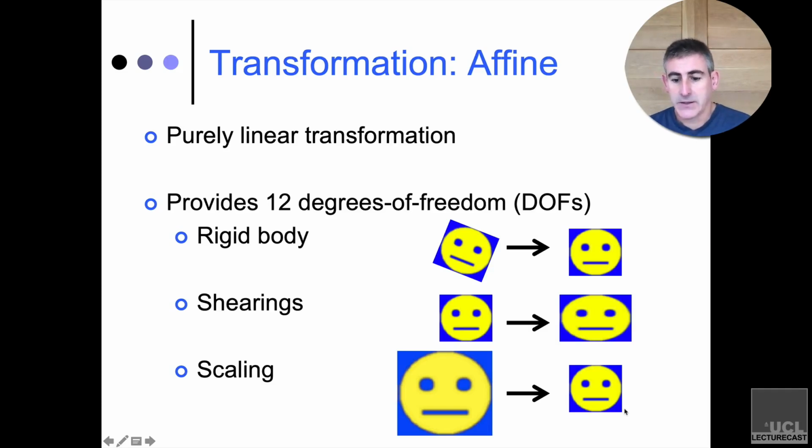The nice thing about a linear or an affine transformation is that there's only one solution. If you have 2 images and you apply a linear transformation, as long as you start with the same 2 images, you will always find exactly the same transformation. Doesn't matter what software you use, there is one solution and it's a solvable problem. And that makes it a very, very efficient thing to do because it's easy to calculate, and moreover, it doesn't vary from person to person, software to software, package to package, which is important because it means that everybody's solution is the same, right? Which makes them very comparable to one another. You can compare like with like when you're comparing linear transformations.